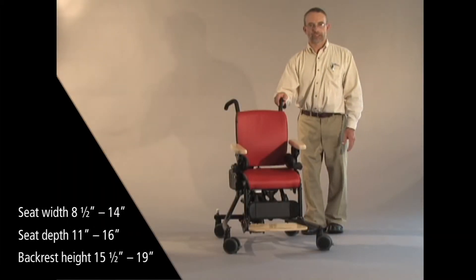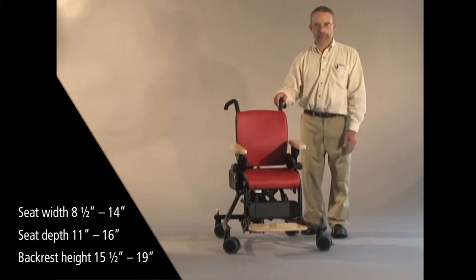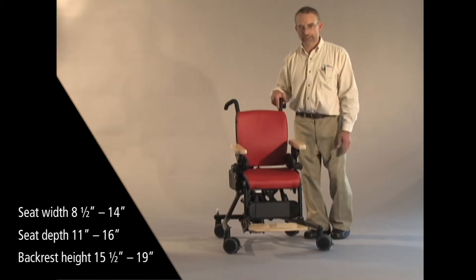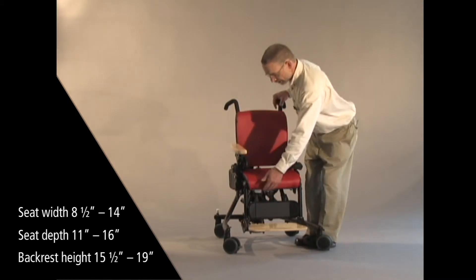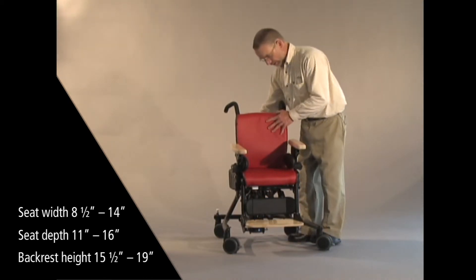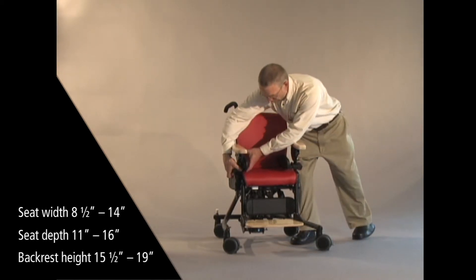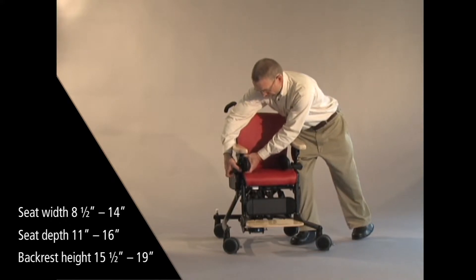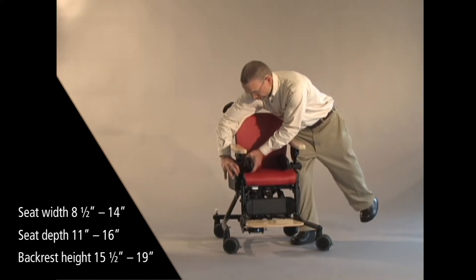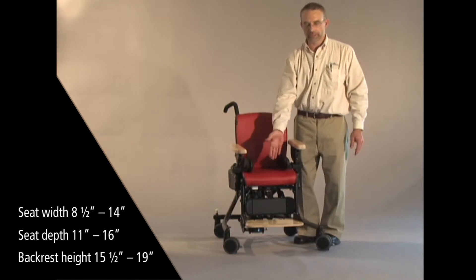Many therapists have asked what adjustment range we have in the medium-sized chair. So to demonstrate that, I'll put it at its smallest setting. With the seat depth all the way in, the backrest all the way down, and our hip guides adjusted all the way in laterally, we have a seat area that is 8½ inches wide by 11 inches deep.